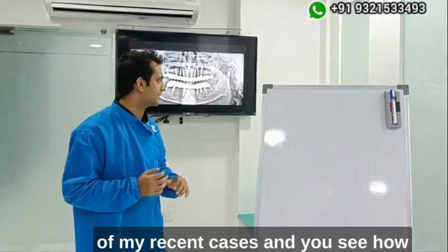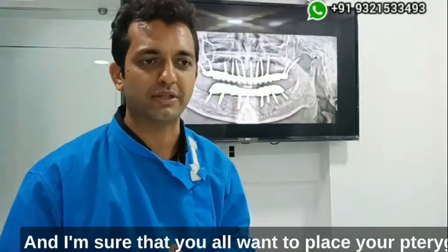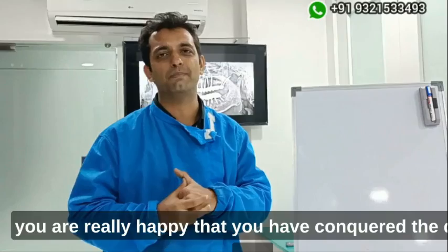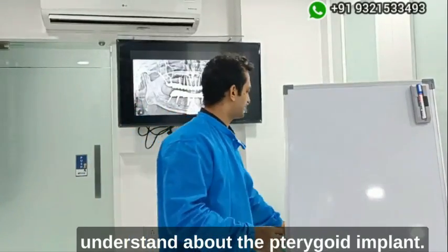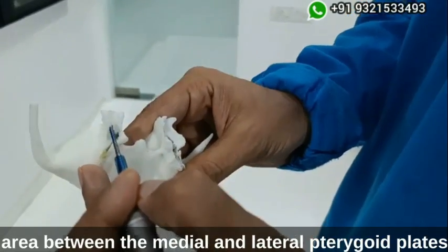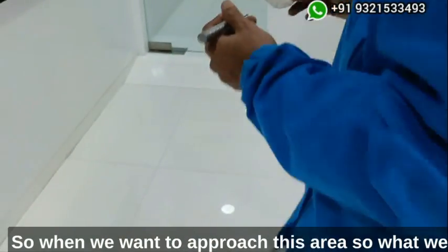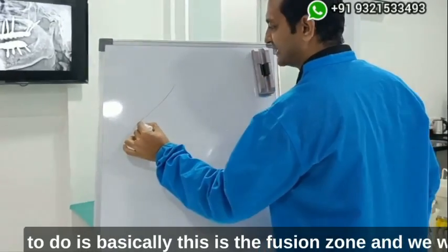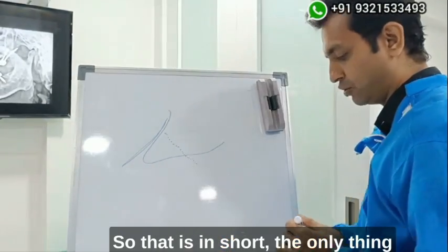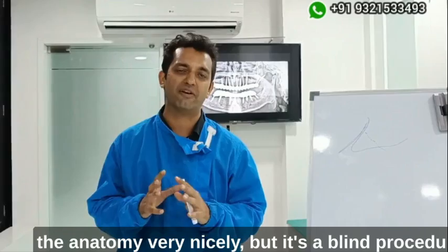Let me quickly show you one of my recent cases — see how beautifully the pterygoid implants have come up. You want to place pterygoid implants like this, getting a very nice torque and conquering the distal part of the maxilla without doing any sinus lifts. The fusion zone is the area between the medial and lateral pterygoid plates, which we want to target by approaching from the tuberosity area.